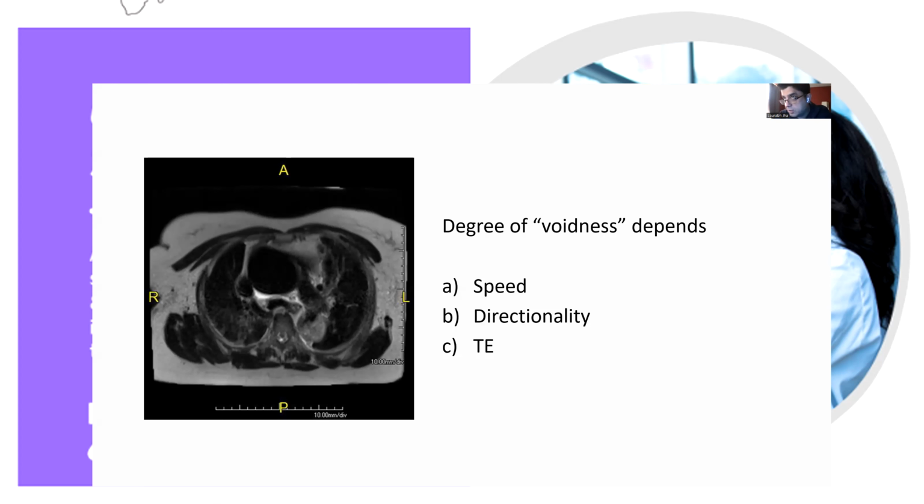So this patient has a dissection, a tear in the aorta, the descending aorta. This is the false lumen where the blood flow is slow. This is the true lumen where the blood flow is fast, or as usual. So in the false lumen, blood actually doesn't escape the slice and gives out signal as it's supposed to give out.